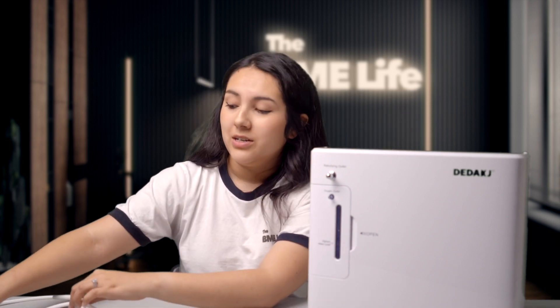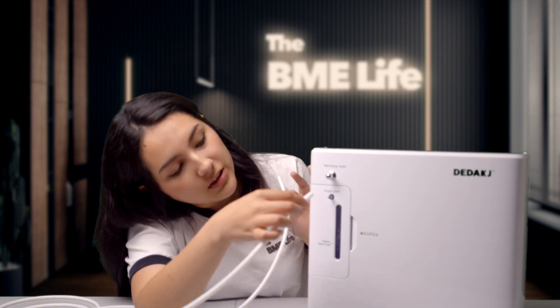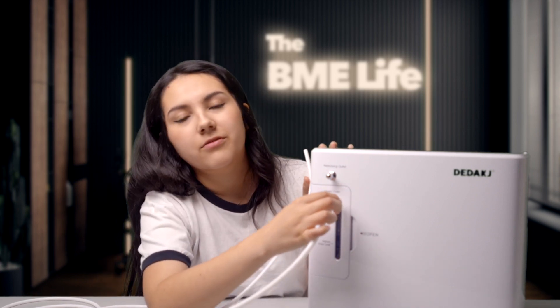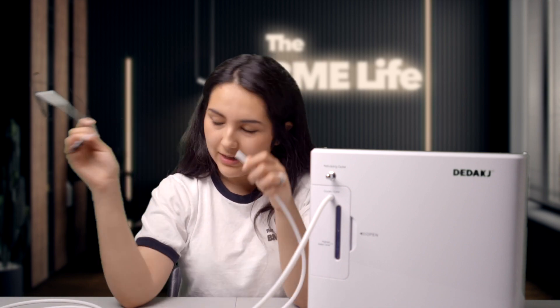After you've filled up the water tank, the next thing you'll want to do is connect the tubing. You'll notice that the tubing has two ends with different diameters — one larger, one smaller. You place the larger diameter end on the oxygen outlet at the front of the machine and push it all the way in. On the other end, you can plug in whatever you're wanting to use, whether it's the headset, the cannula, or whatever.